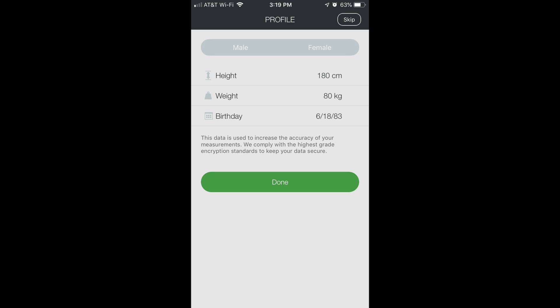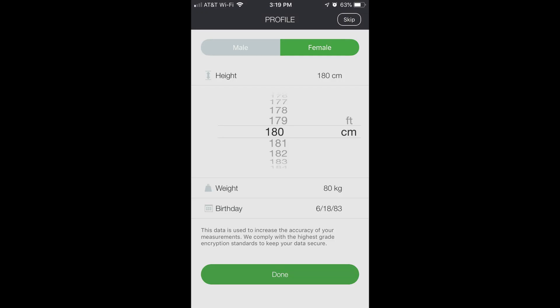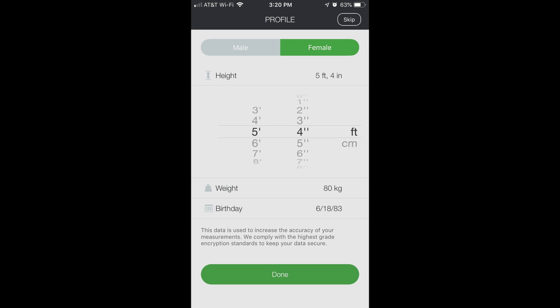Do I have to tell the truth? It's your doctor. I'm female, and my height — this is in CM. To make it inches, just hit the little 'feet' icon. I'm 5'4". That's done.